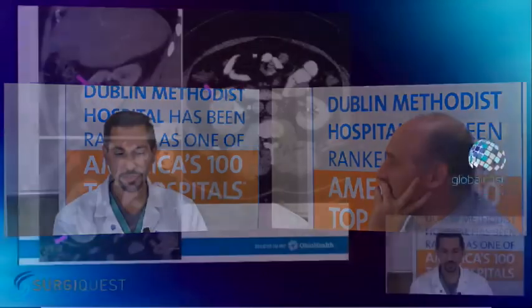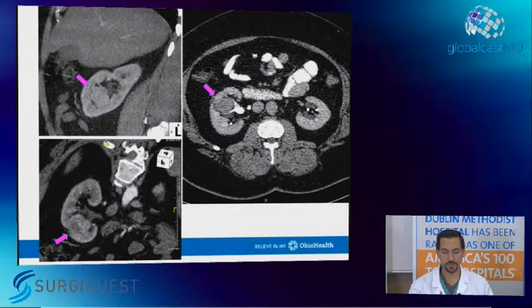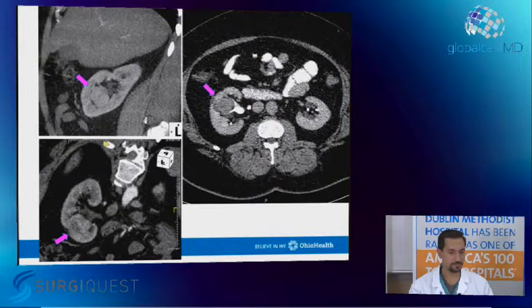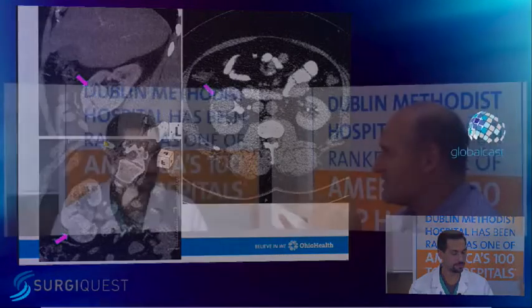So Lee, any comments? Anything you would do differently here? I agree. I would do the partial. So looking at this scan, what would be your planned approach in terms of where you would excise this? Yeah, the good news here is that it's a little more towards the lower pole, so you don't have to really do this digging out in a hole, whereas when tumors are really in the center of the kidney, those tend to be the most difficult. So I'm going to probably do a lower pole hemi right across the top of this. I'm going to take off that lower calyceal system with the tumor and then sew that defect, and he'll have half his kidney left when we're done.